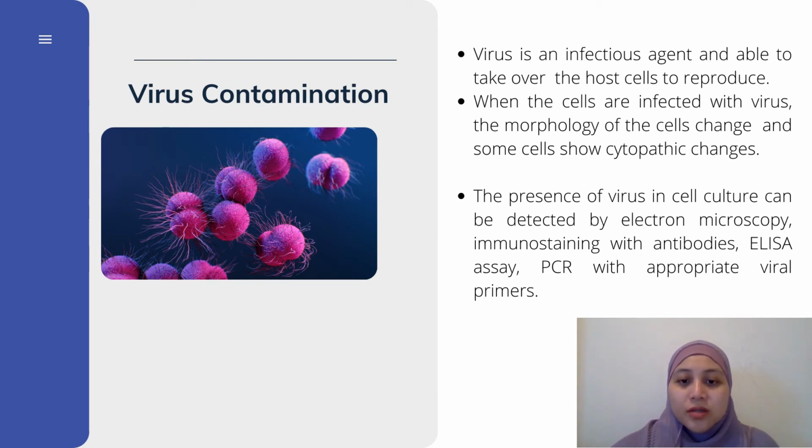They can also look like fuzzy patches as shown in the picture. Virus is an infectious agent which is smaller than bacteria in size. Virus can take over the cells and use them to replicate. One thing that you need to monitor is to observe your cells for any morphological changes and also whether there are any cytopathic changes that occur in the cultured cells.